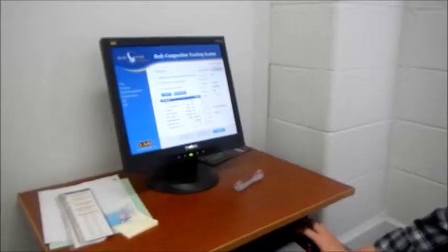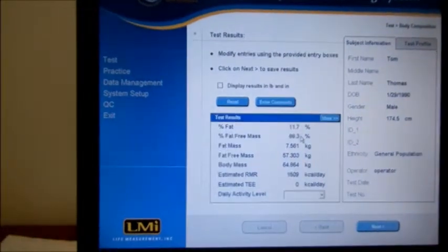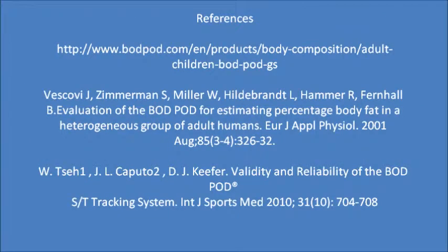Results screen. The bod pod can be used for anthropometric measurements. For patient client management, the bod pod can be used for anthropometric measures with better reliability than skinfold calipers and BMI, as well as a tool for health promotion and wellness.